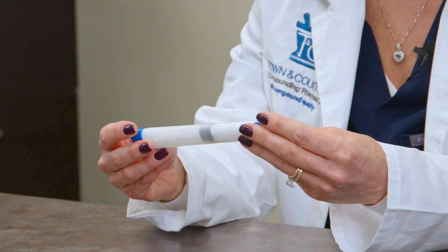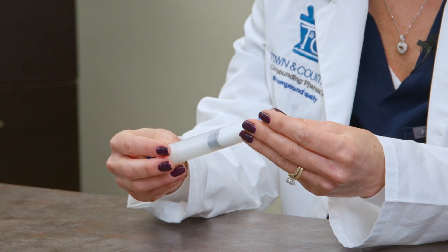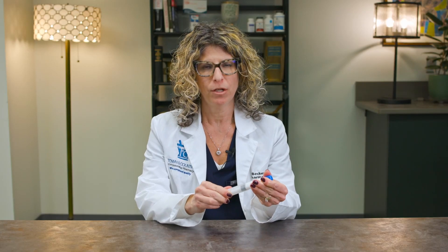This is a device that is usually given to you when you receive a testosterone prescription, preferably for women. It doesn't appear to have a large amount of medication in it, but it certainly does. It is quite potent even though there's a small amount of medication that comes out with each dose.